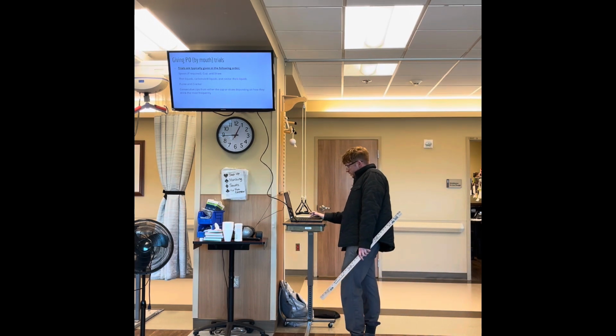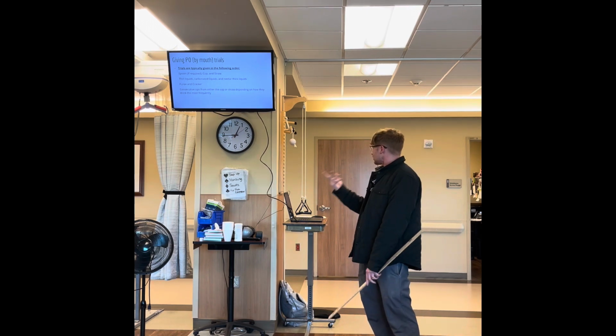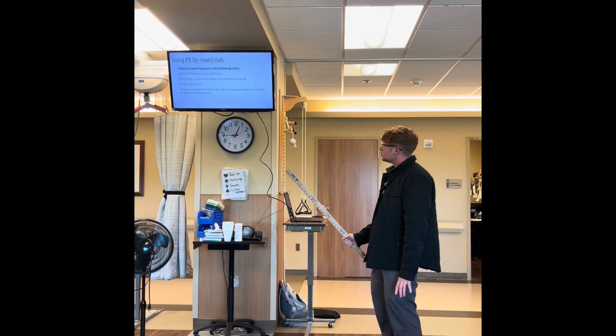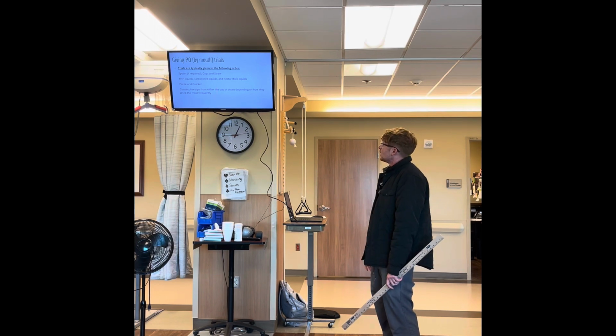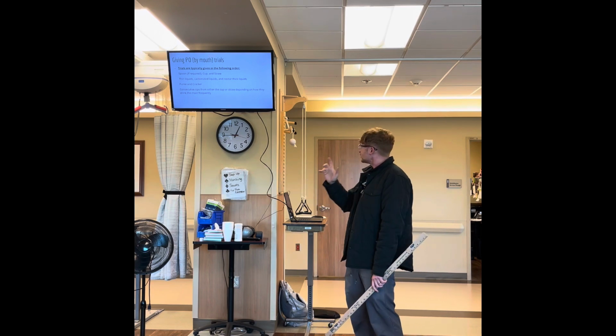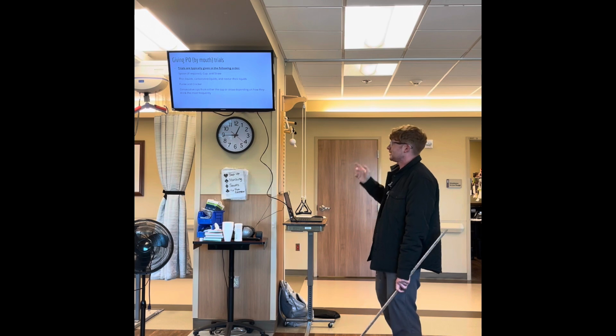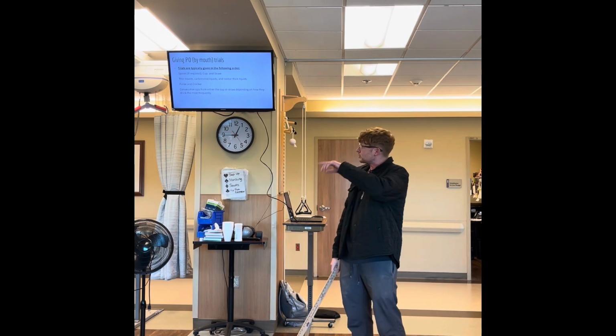That's the case history. Once we've told them what's going on, we know what's going on, we can start giving them trials. So we'll give PO trials, PO by mouth. This is usually the order we do. I don't know if they do a different order. Most times we'll go thin, carbonated, then nectar thick, and we will do the order spoon, cup, straw.